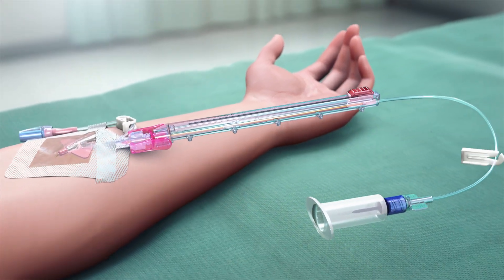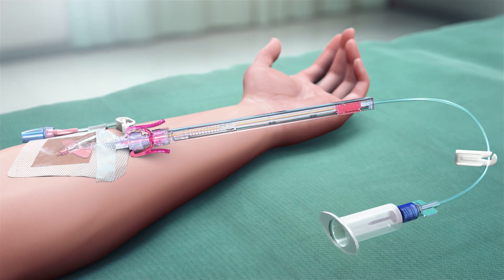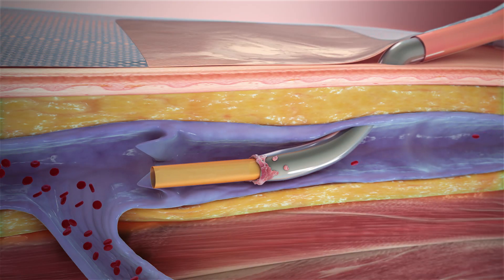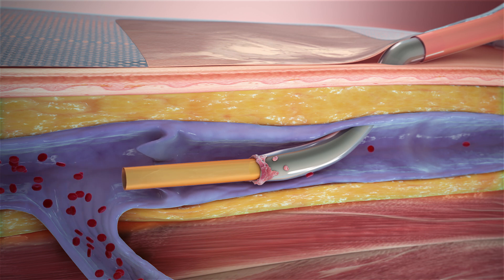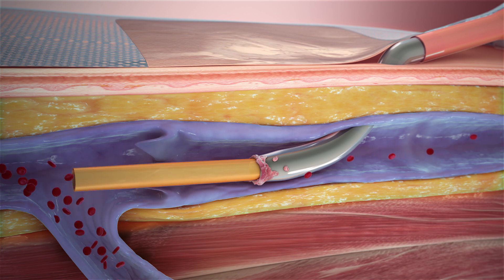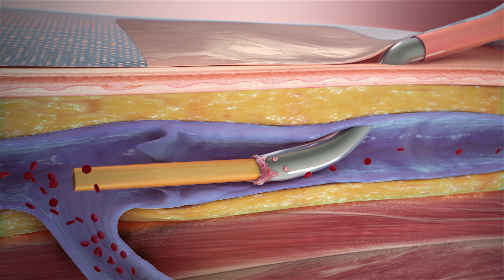After connection to the peripheral IV catheter, moving the device slider forward advances an internal flexible flow tube through the catheter and into the vessel, moving past the often suboptimal draw conditions around the catheter to reach vessel locations where blood flow is optimal for aspiration.